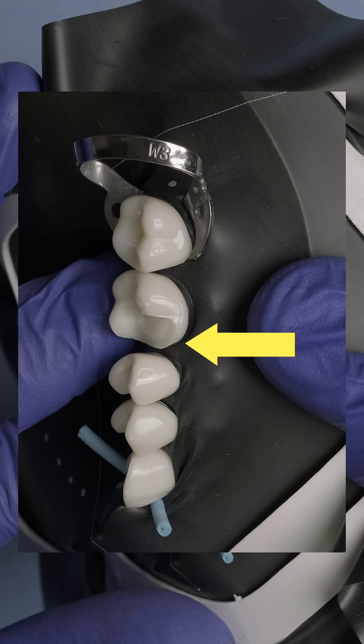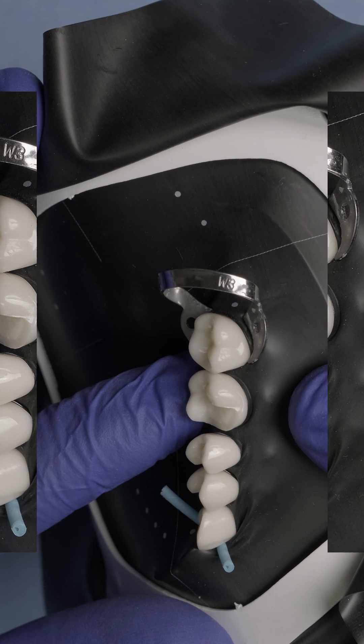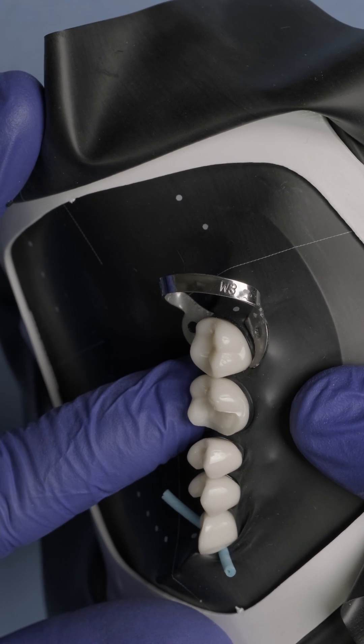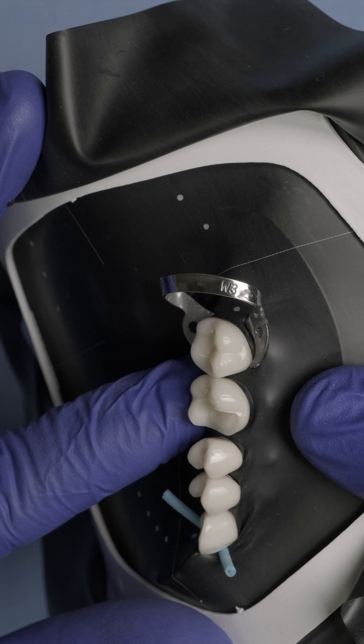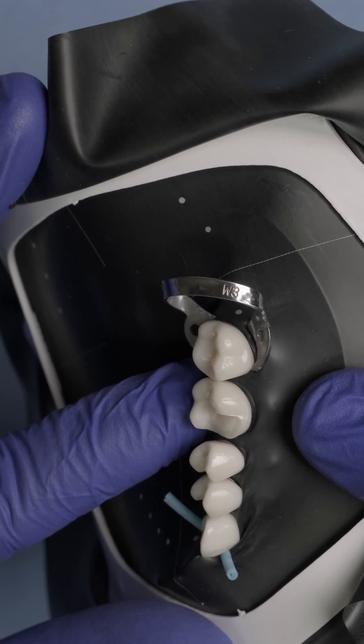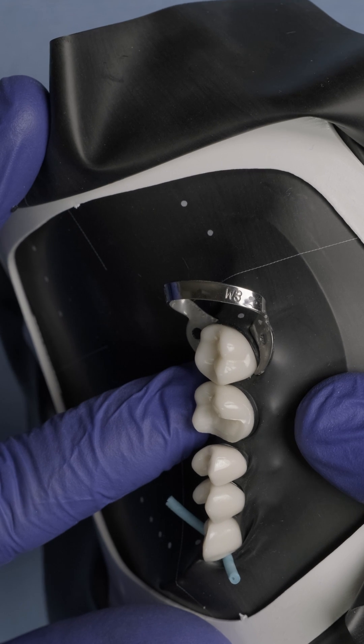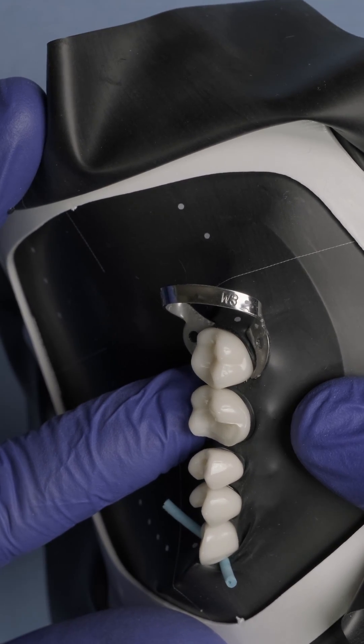Because the rubber dam is inverted correctly, subgingivally, it has pushed that gingival margin more apical, and now you have clean access. There is no bleeding, there is no saliva that's going to come through that rubber dam. This is how you should perform operative dentistry.